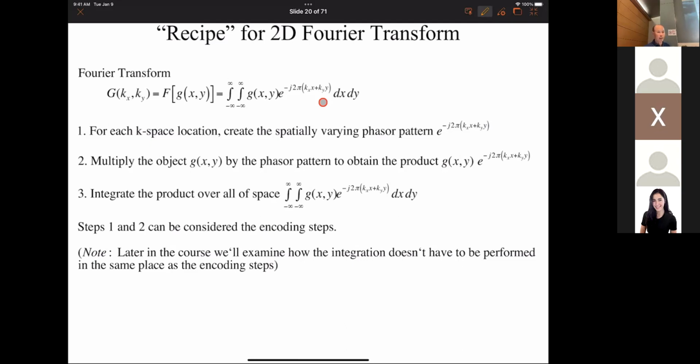Because basically it's just a matter of how far you're willing to go into K space, right? For example, in certain experiments where they want really high resolution, let's say you get a dead brain, you take the brain out of the head, you put it in formaldehyde, and then you can just scan it for days and get super high resolution, because you can afford to go out to really high parts in K space. For a human being in the ER, you maybe only have 5 minutes, right? So you're on the clock. So that's the trade-off, right?